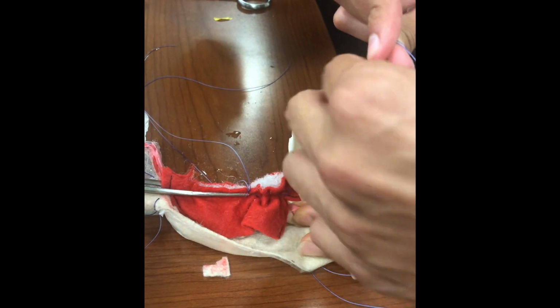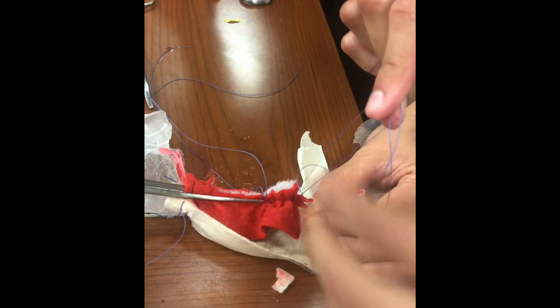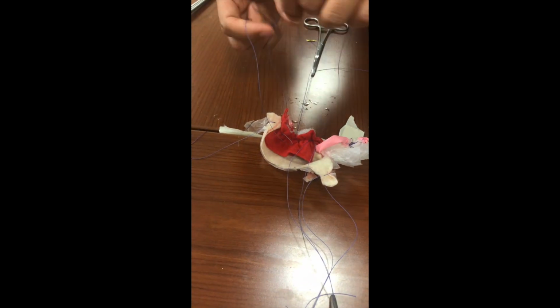For future directions, we could work on creating a surface or platform for stabilizing and holding the model in proper position. Repeat the process on the other side of the vaginal cuff.